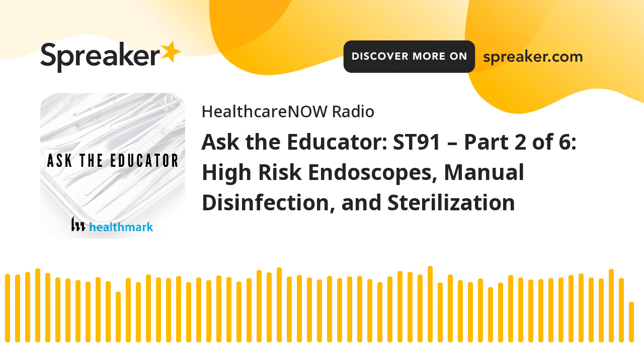And that's because there is so much data out there now that supports that an automated system, an AER, can do a much better job than we could ever do manually. The variability is taken out of it. The inconsistency is taken out of it because we're only humans, right? And we've done all these steps of cleaning before that.